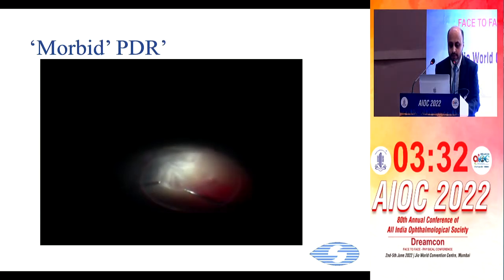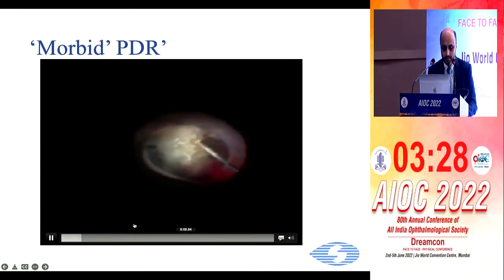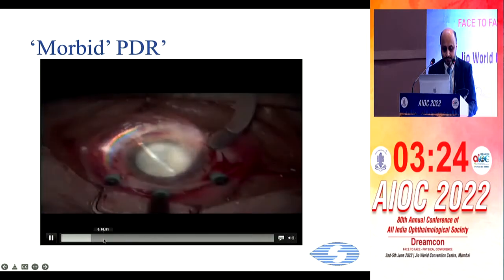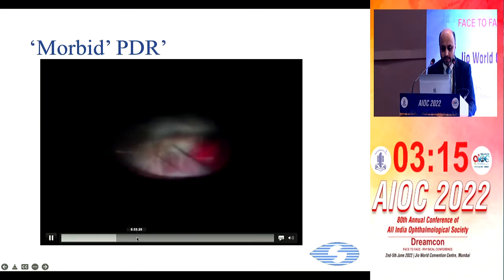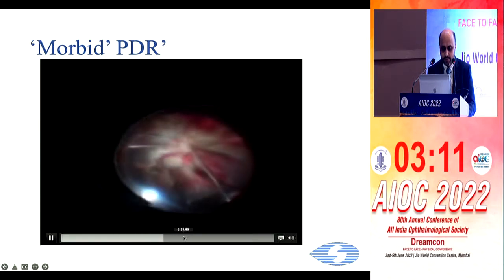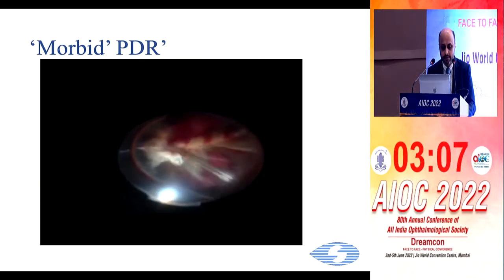So I think it is important to keep the cutter tip up and go layer by layer, and slowly identify all the structures along the way, and clear up the heme, ultimately again going to bimanual vitrectomy and managing the membranes. Ultimately this had a detached retina also, so we very carefully dealt with all the membranes and completed the bimanual surgery.